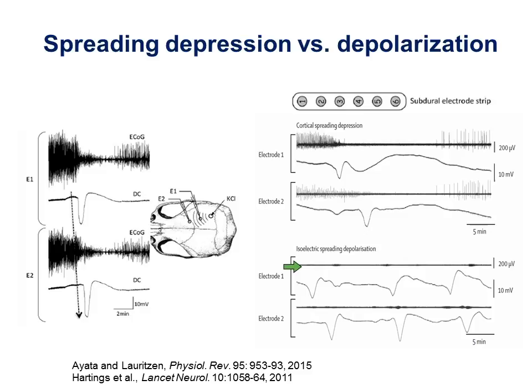So comparing here to here, we can see that the brain in this instance is flatlined. There's no spontaneous activity. That doesn't mean that the brain is dead. Rather, to the contrary, the fact that we can observe these repetitive depolarizations indicates that the tissue remains viable. But what's important here, the point I want to make, is that spreading depolarization does not always cause spreading depression, because that is in the cases where there is no spontaneous activity to depress. And these are known as isoelectric spreading depolarizations.